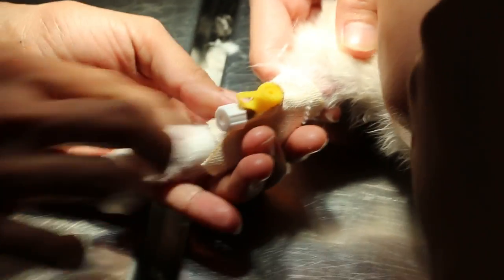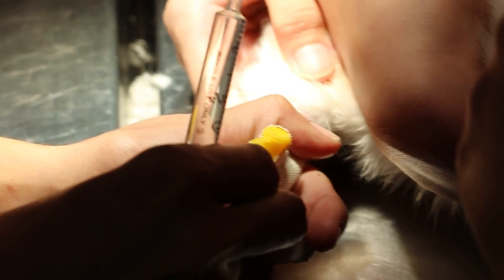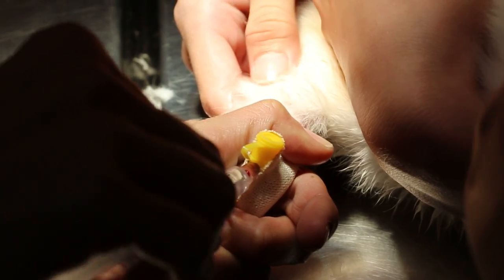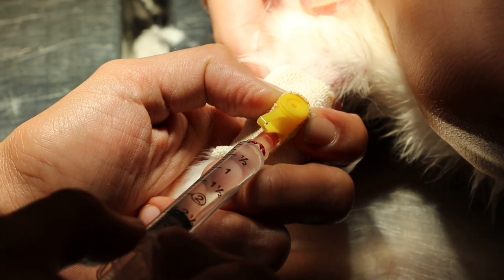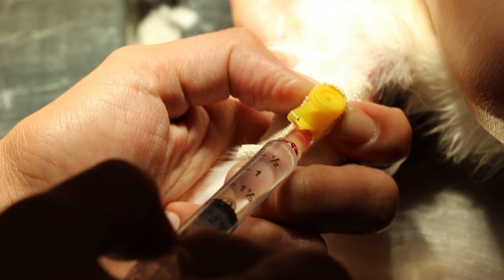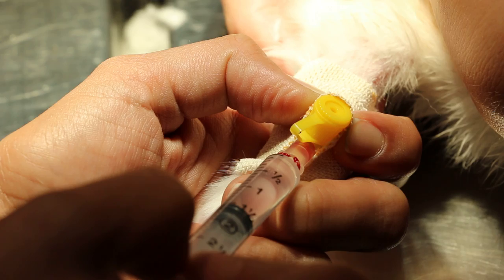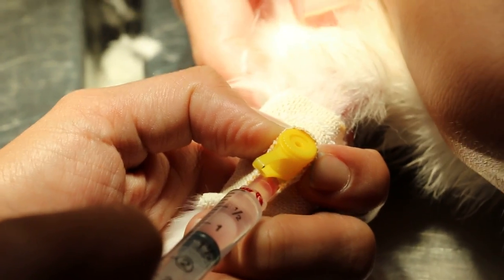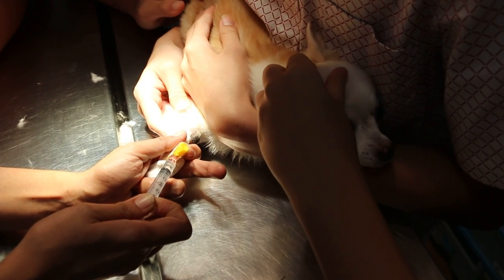You see, that is the reason for having a catheter — you can give more than one time. Good job. So we give IV: glucose plus Hartman first, plus Baytril 0.3. It's all inside the syringe. So this is how you ensure that the dog gets the fluids directly. Very slow — if you go too fast it might cause heart attack. Very slow.